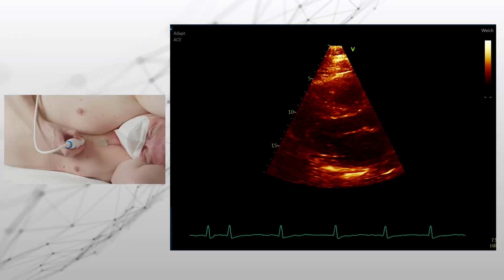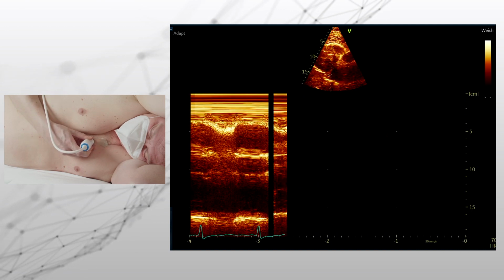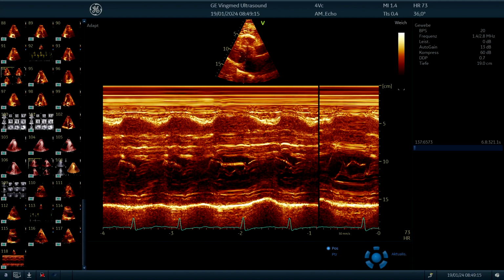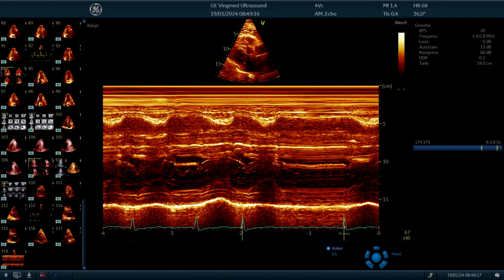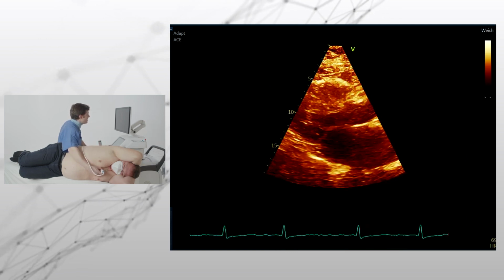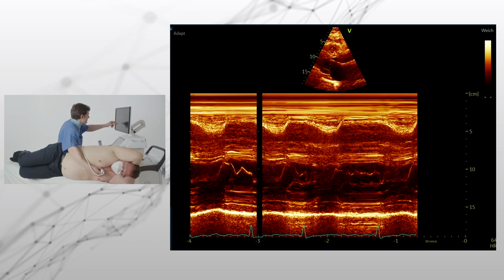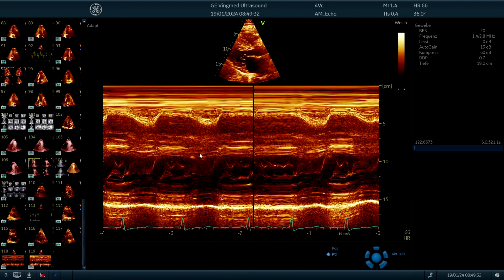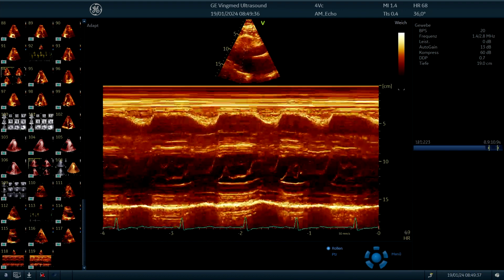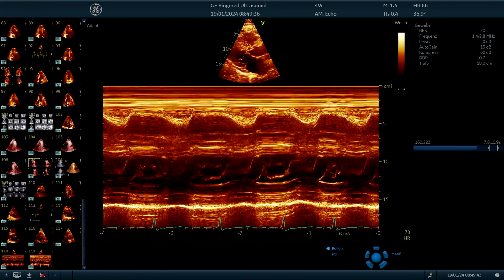We can also try, just for demonstration purposes, to go back and use the M-mode also in this area, because the M-mode simply shows the structures over time, and here there is this SAM phenomenon present. But be aware that a chordal SAM, or really the LVOT obstruction, it doesn't really matter. So the M-mode just depicts the structures you see. So that's the mitral valve, the opening, and then you have this pulled motion from the chordae tendineae towards, here was probably the best signals, towards the LVOT.